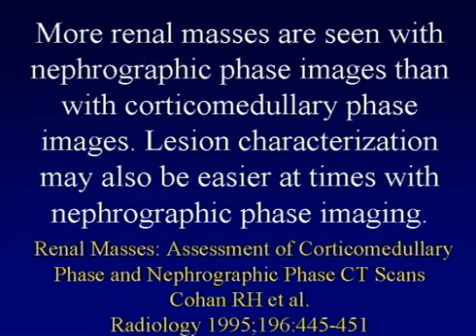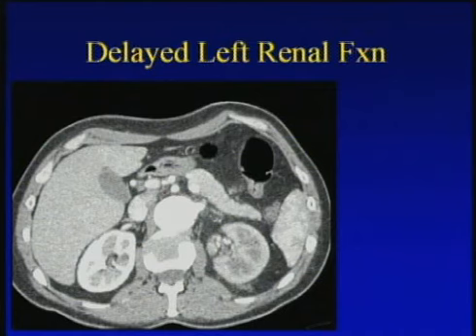And in these days of 16 and 64, there really is typically not the same problem. And also the reality is we would never recommend only doing a corticomedullary phase acquisition. So we would do that phase plus typically an excretory phase. So it's typically not an issue. So let's look at its advantages.